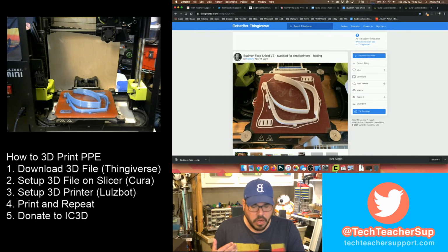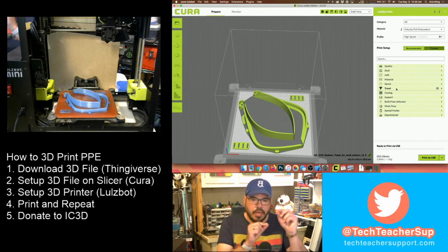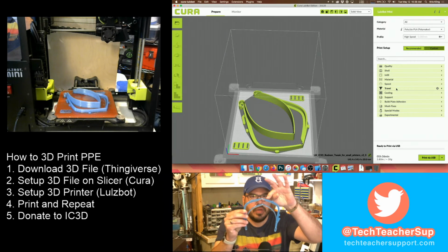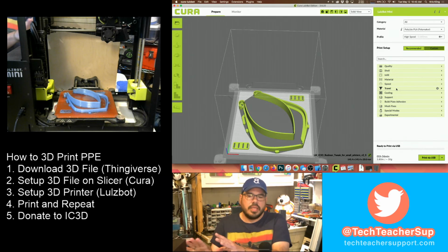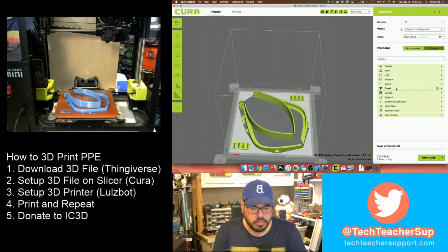But for the most part, what we just need to tell the printer to do is kind of change the way it builds this a little bit, because there's this hinge in the middle, and we don't want that hinge to break. So we're telling the printer to not stop on the hinge and to essentially build this a little bit differently than it normally would. So those settings are all in the first video, and you can go in and do those. So those have already been done. We are ready to go.